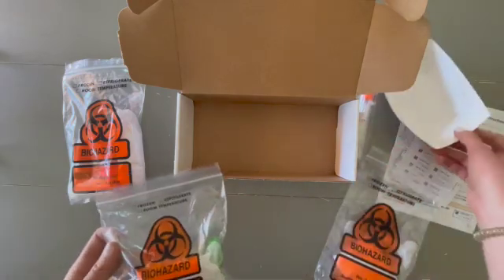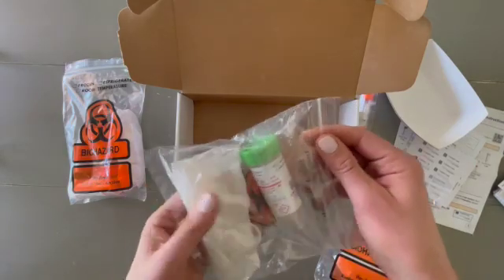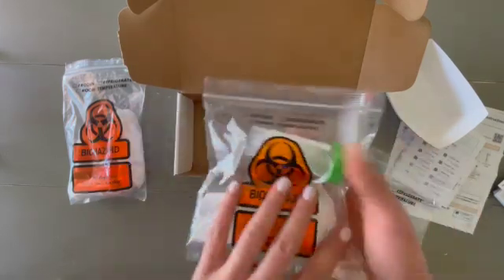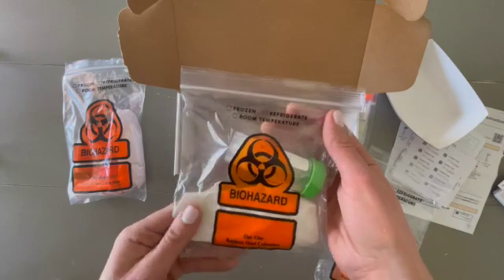As you get into the kit, you'll start with day one. We've talked before about why we're doing a three-day collection — we're really trying to make sure we capture any parasites or pathogens, and three days increases the chance that we'll actually find something.